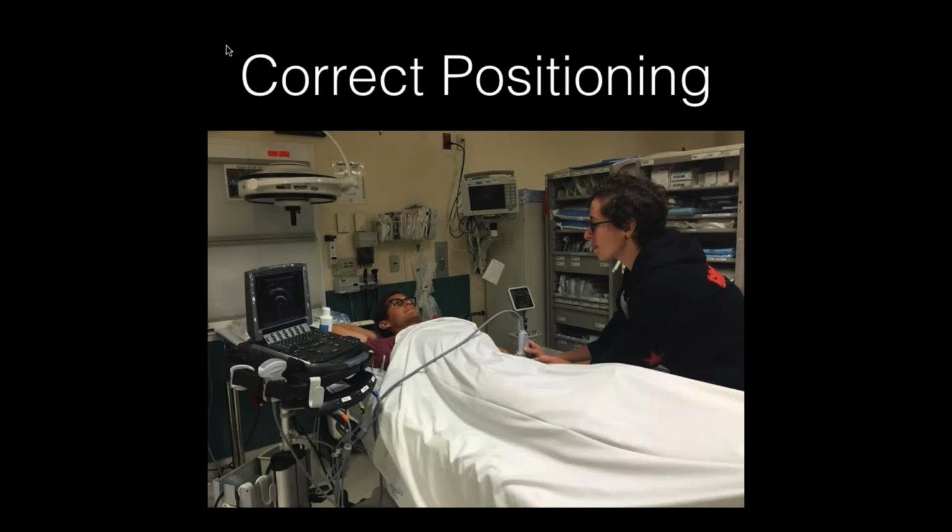Instead, you're going to want to place the ultrasound across the bed from the provider such that the provider's gaze only has to drop a little bit between the ultrasound screen and the skin insertion site for making minor movements to adjust what she's doing in the patient's tissues to reflect where she wants to go on the screen.